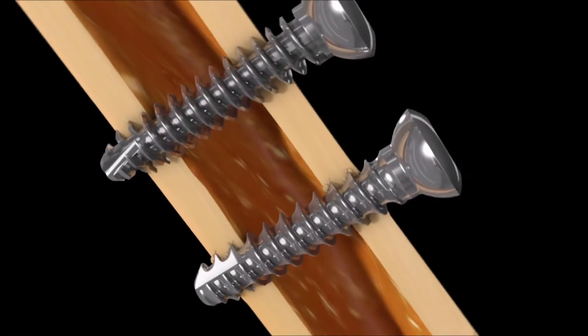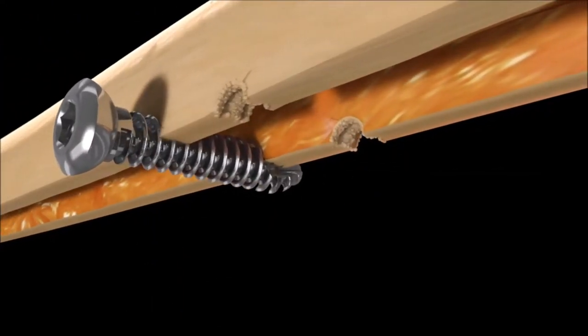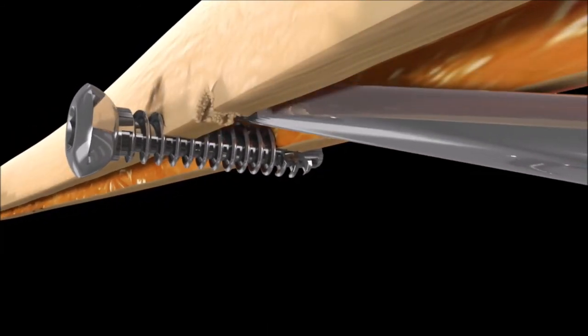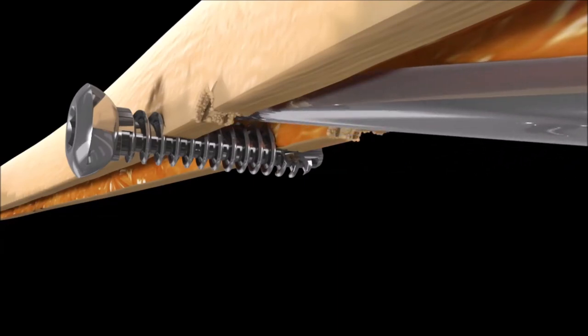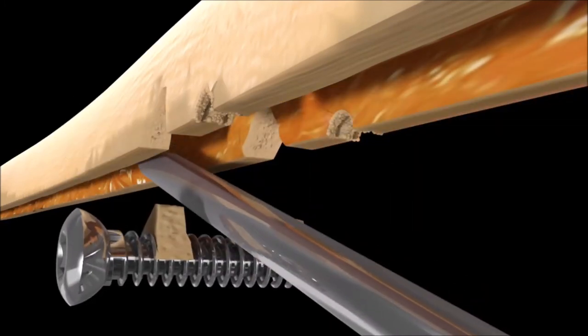This notion is also nicely illustrated in this graphic animation that demonstrates the solid interface of the interlocking thread of the bone screw fastener. If failure occurs, the bone breaks out with the screw due to the solid nuts and bolt interlocking technology.